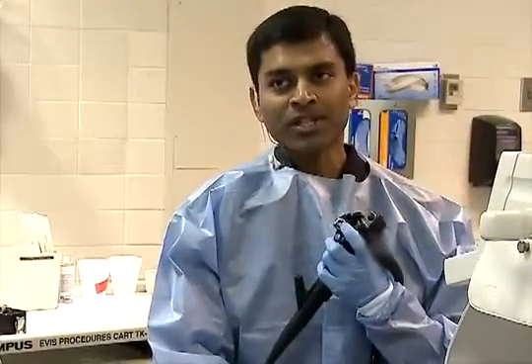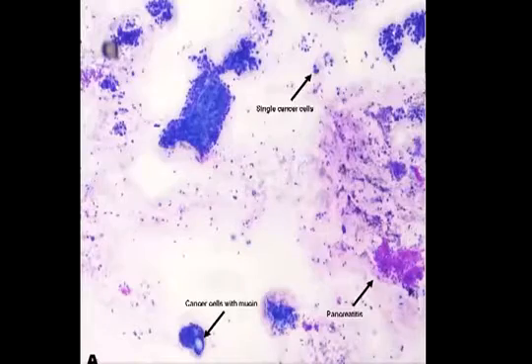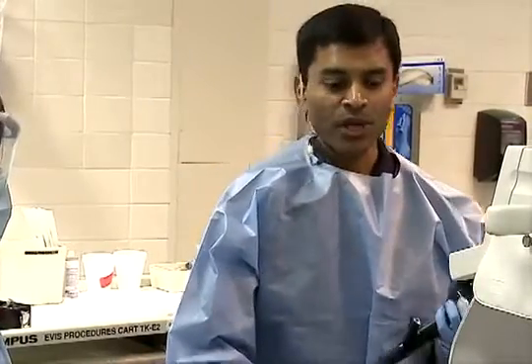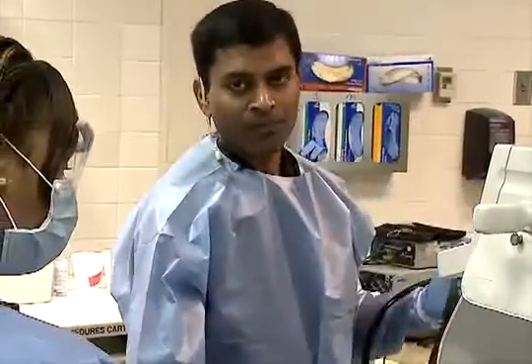So in this particular patient, after the very first pass, we have a diagnosis of pancreatic cancer. We also found similar representative material on the second pass as well. So this patient has resectable pancreatic cancer. There is only invasion of the splenic artery, which does not preclude surgery.